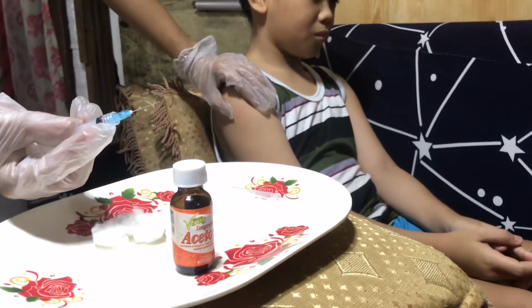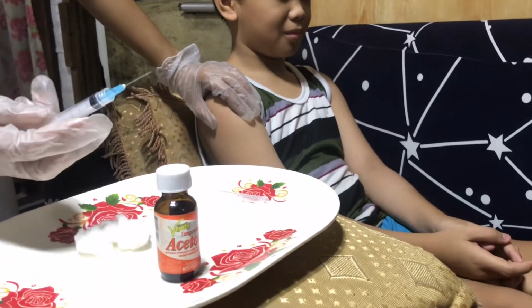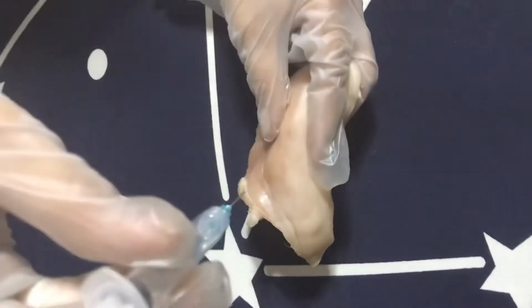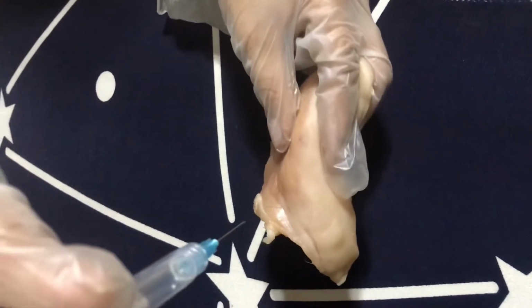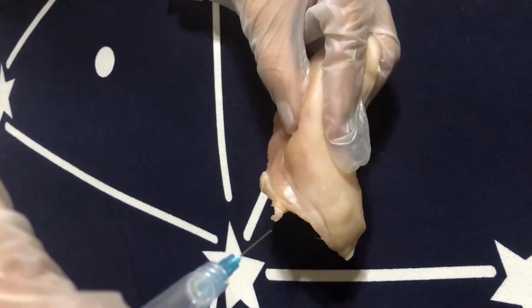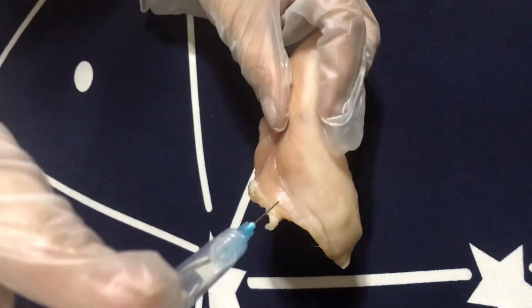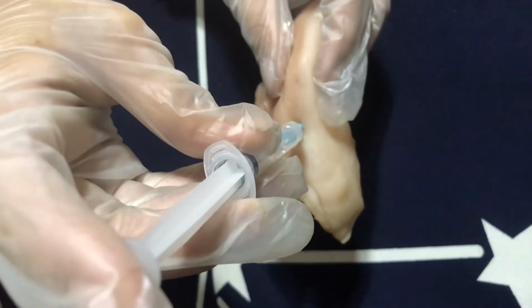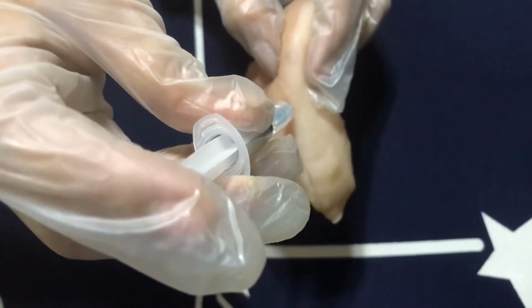Move your dominant hand to the end of your plunger slowly. Inject the medication over several seconds. Retain your grasp on the syringe to keep it still. So after removing the needle cap, insert the needle quickly and firmly at a 45 to 90 degree angle. Release the pinched skin, rest your non-dominant hand on the patient. So after that, I will be inserting the needle quickly. Then move your dominant hand to the end of the plunger and slowly inject the medication over several seconds. Retain your grasp on the syringe to keep it still.